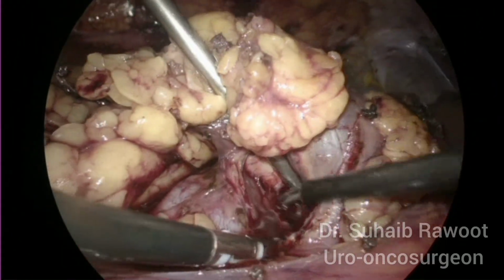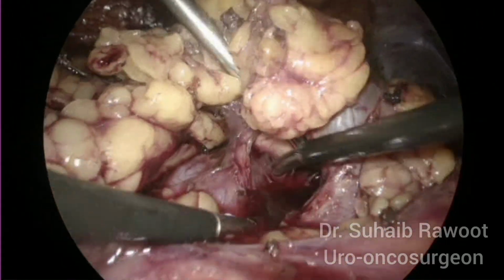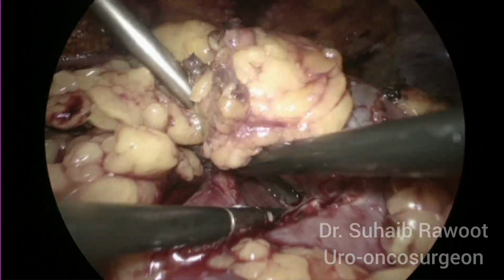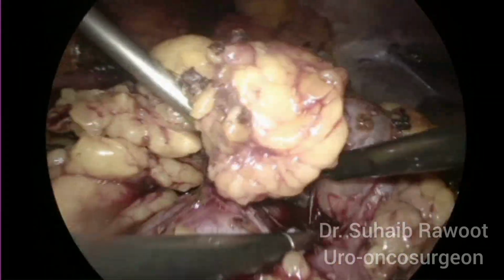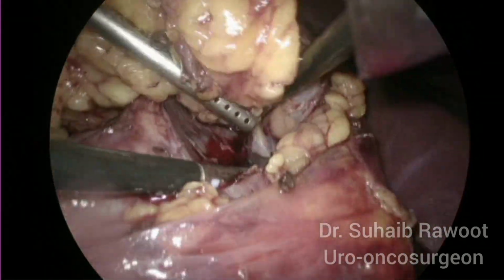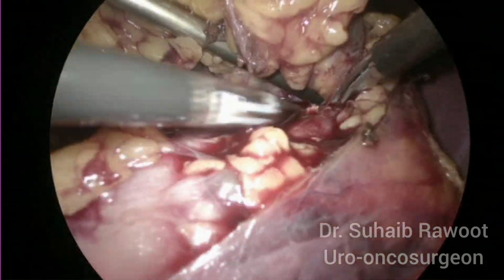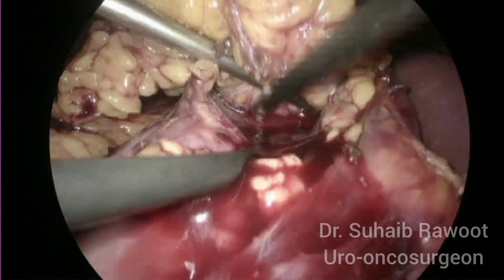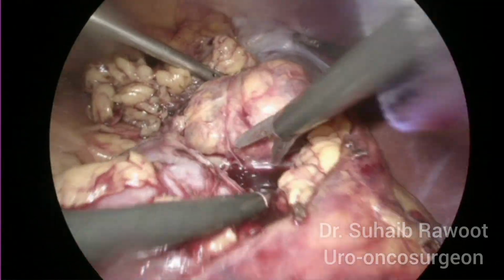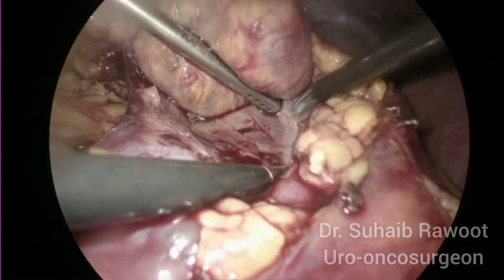So one hand of the assistant is retracting, the left hand of the surgeon is retracting the other end, and we are developing a plane and cutting along the plane. As you can see how nicely the tumor has been lifted up without encroaching the tumor capsule.